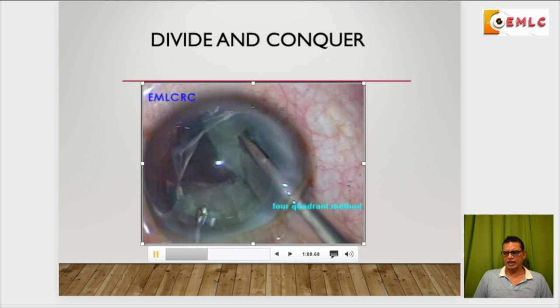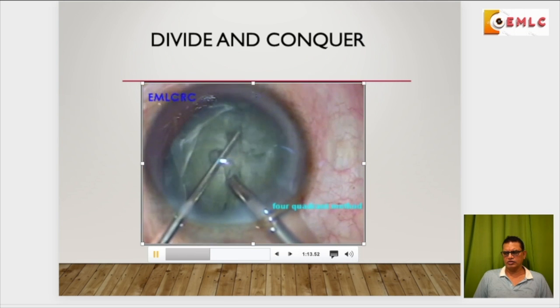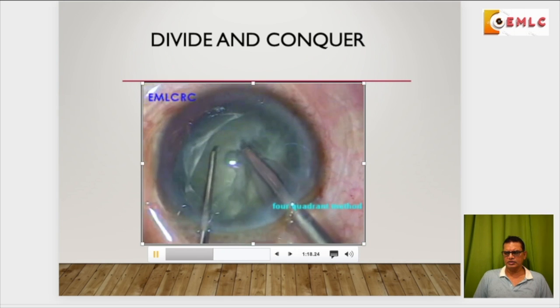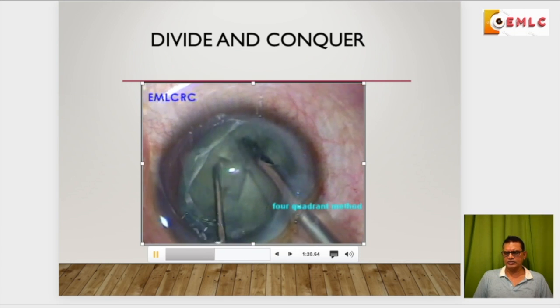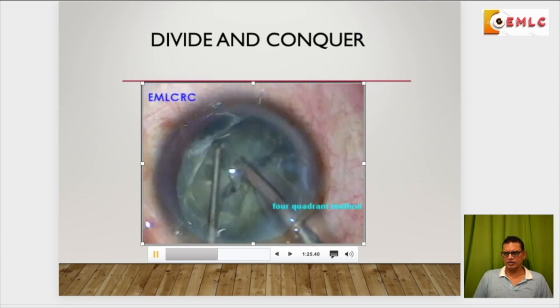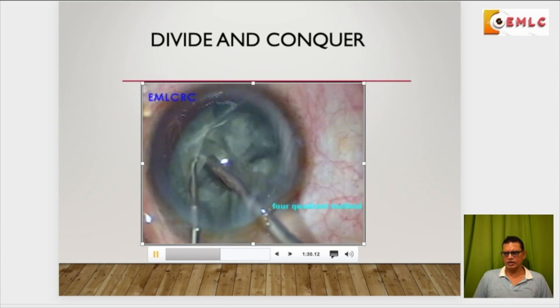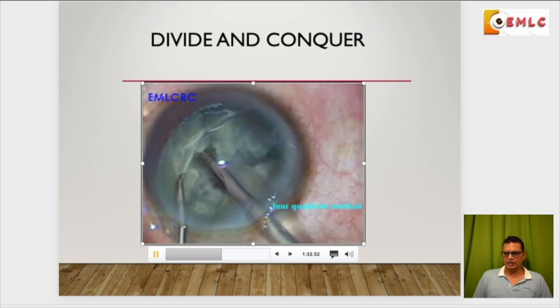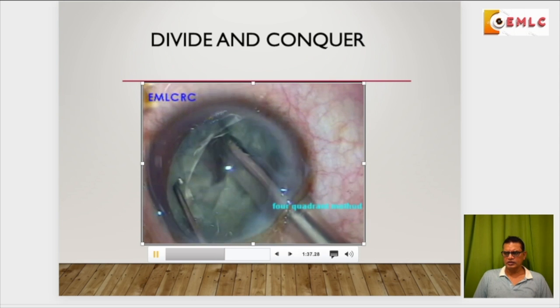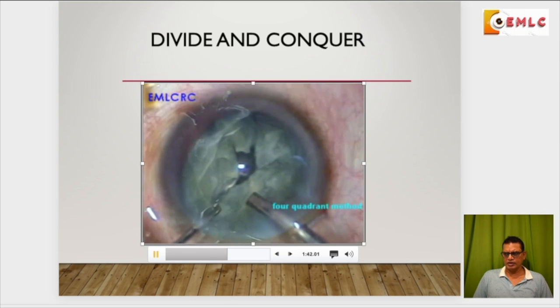This is the first crack which has gone beyond the center and it was completed to the other side. Then I rotate the nucleus, do the next crack. This was not very accurately done. The crack has taken place away from the tensed portion. So I'll make another crack so that I get equal sized pieces. Now I have made it at the tensed portion of the nuclear fragment.